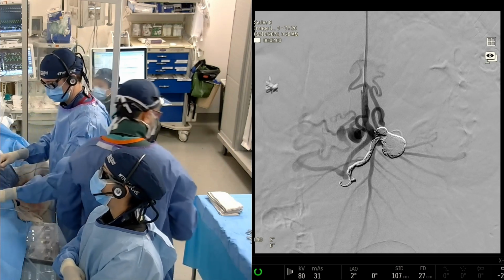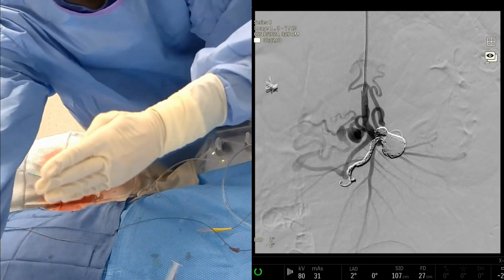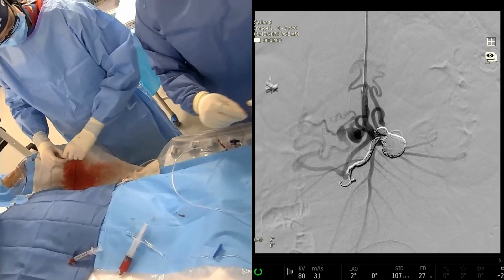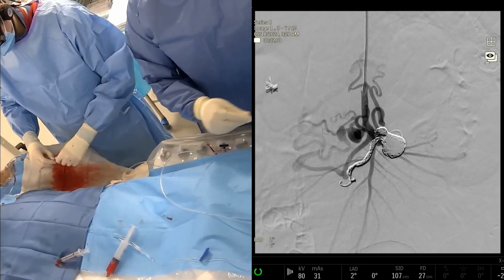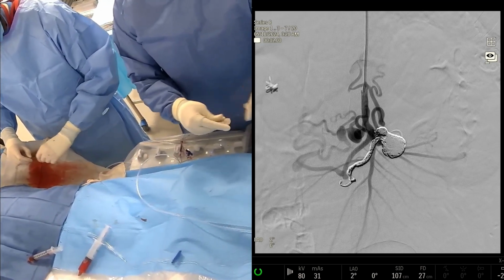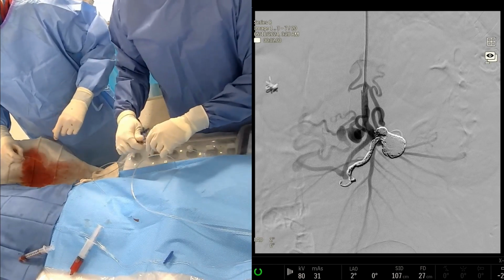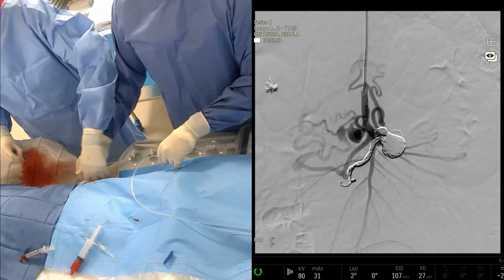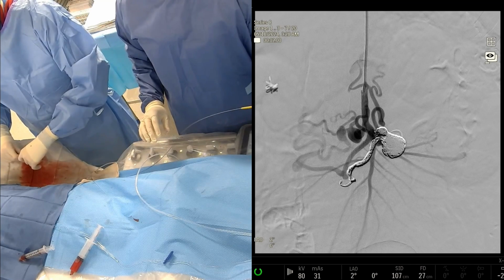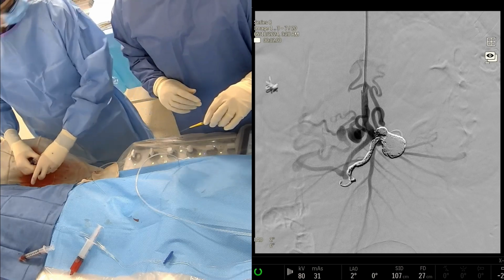So do you think that you would be able to get it to stay in the aneurysm, and it may stay? Where is the branch coming off? I think it's going just slightly to the left and then coming across. I think this angio shows quite well the collateral pathway. The celiac collaterals are intact. And there's so many that even if you take out those two aneurysms on the right side, it's not going to affect the collaterals at all. Really, the ones going north on the left side are patent.